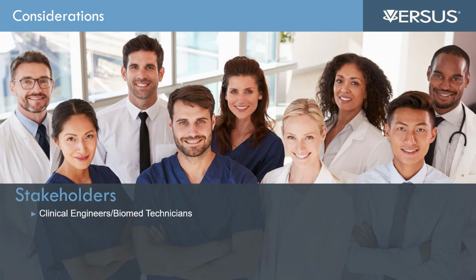And I start here with clinical engineering and biomed technicians because I think their role is often so crucial, and they often drive the asset management desire and are the ones looking to have a system that can work with them and give them that location information. They're also the role that, as I said before, does all that maintenance and repair work, but they're also onboarding new equipment, which provides an opportunity to add stuff to your RTLS system. But I think their role is crucial as a significant stakeholder in the process of managing equipment, and they should be included early on in the process.